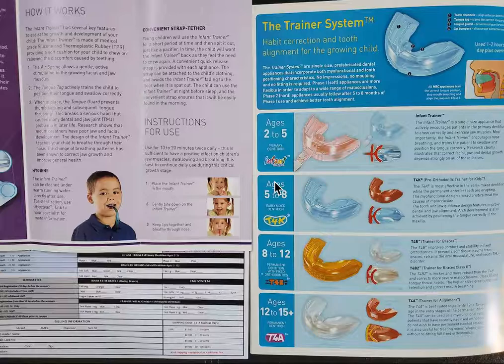So let me give you their narrative on the why behind it, okay? We're going to start with the infant trainer. We've got that, okay? So you've got infant, you've got T4K, you've got T4B, I think it's called, and T4A. These names are incredibly confusing to me, I can tell you that. I can't even keep them all clear.